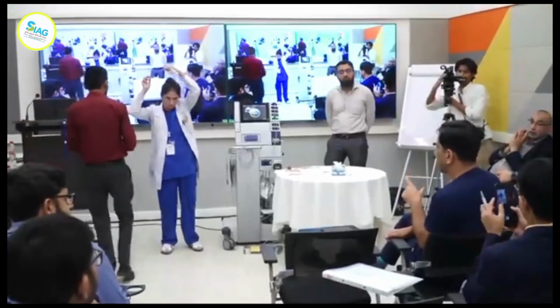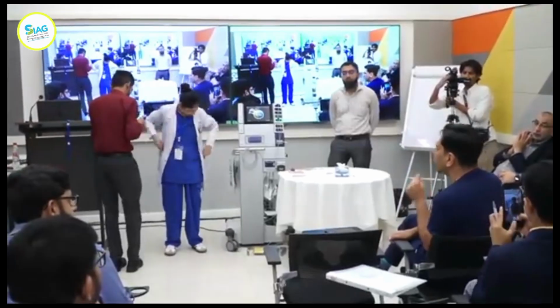Consultants. So, sorry. No. I just wanted to make 2 points. One is ERCP and sphincterotomy in a true sense is also a third space endoscopy because you cannot actually visualize. What you can't see is how long is your common channel. Is it 2 separate openings or is it a long common channel or a short common channel?